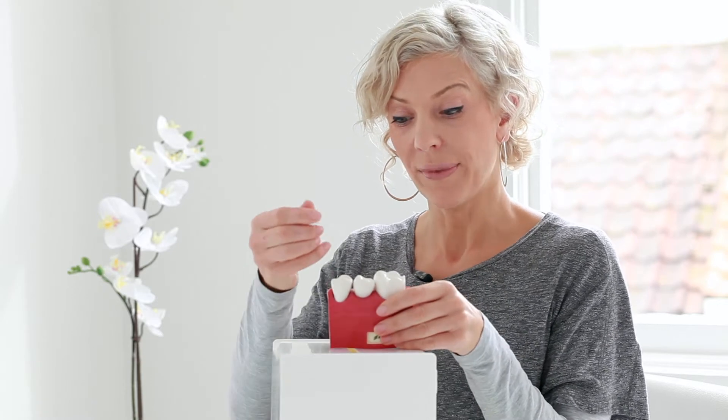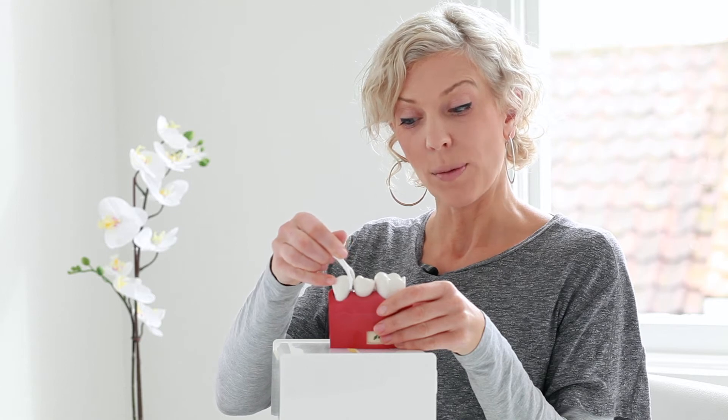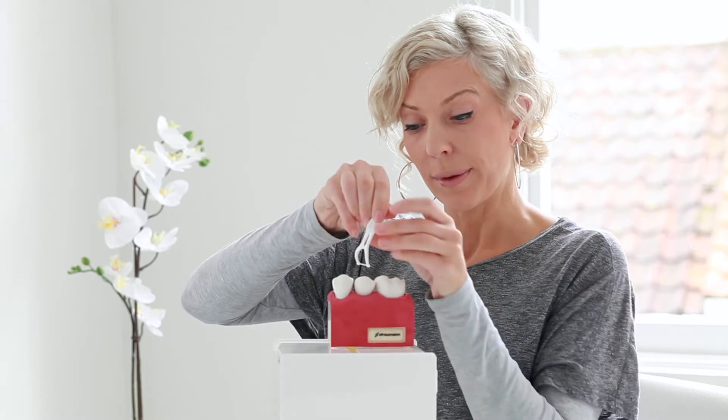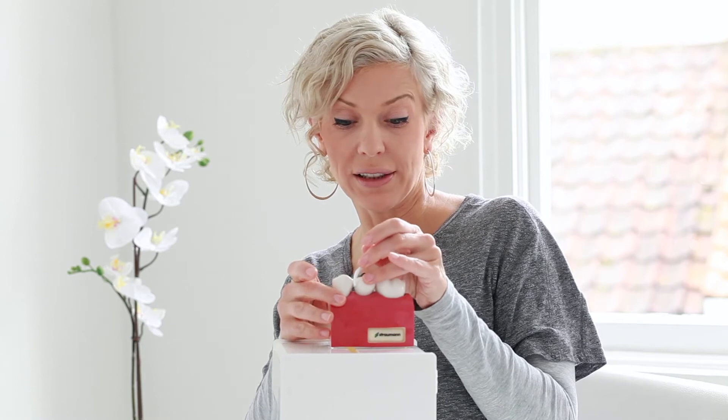Very simply, you pop it down between the teeth, pull it against one side of the tooth, pull it out, give it a wash underwater, same gap, down we go, pull it against the adjacent tooth, give it a wash and then we're done.